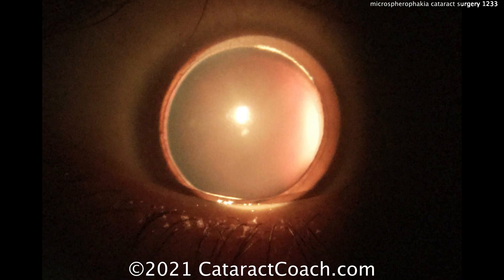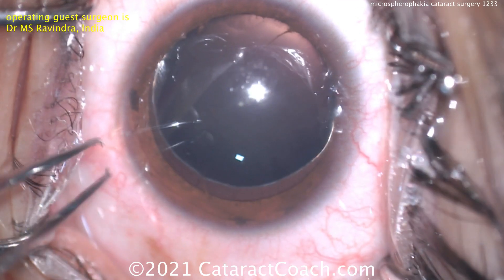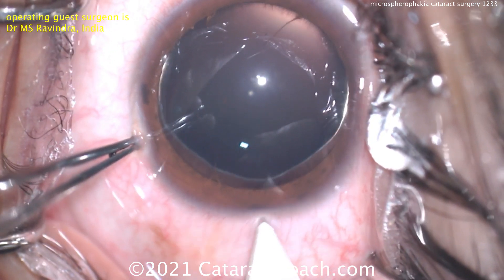When the patient dilates, the dilation is bigger than the lens diameter. So you can see the lens capsule or bag equator 360 degrees. Here on the OR table, you see that same view.